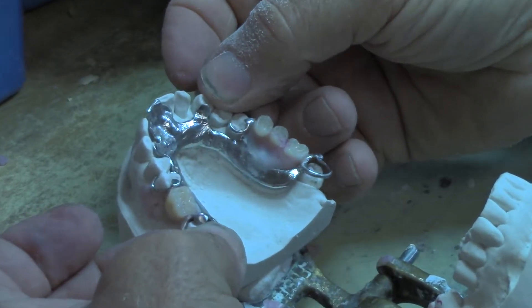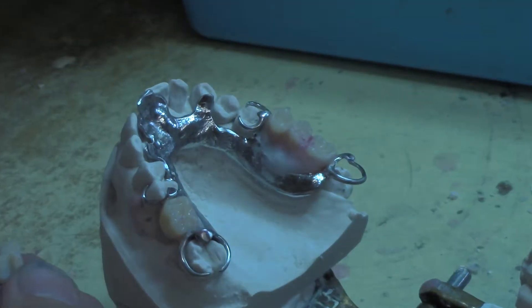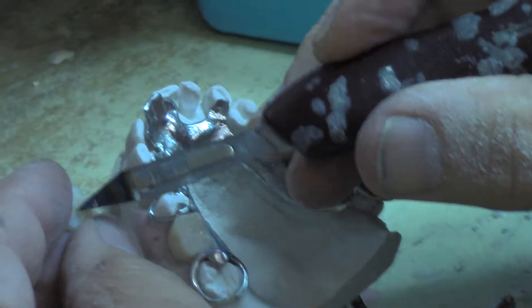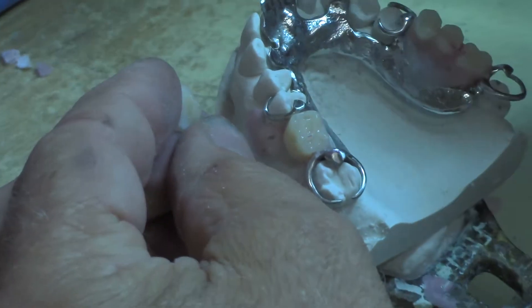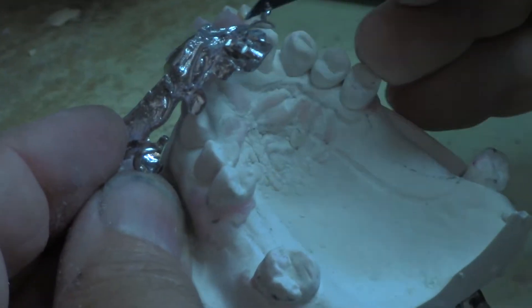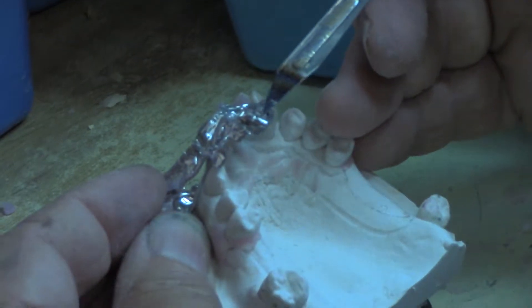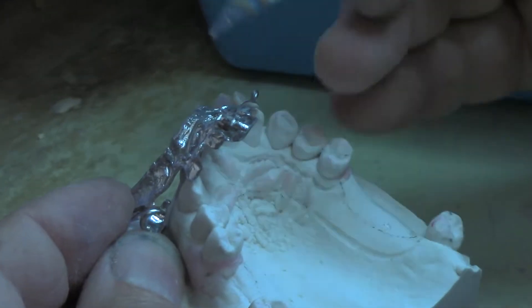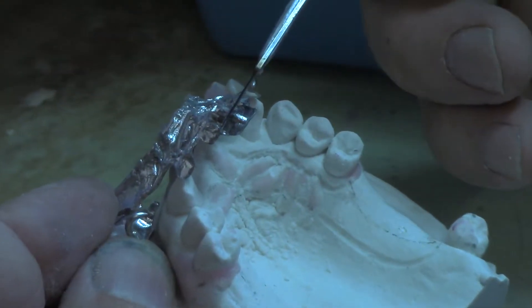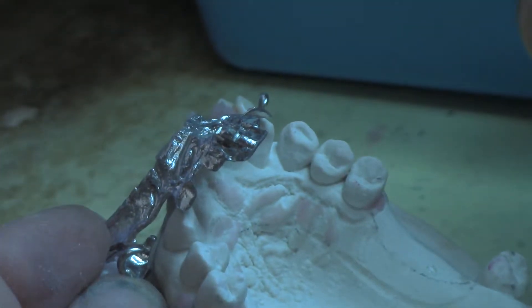I want to show you that little groove here that we put in the teeth when I cast it — and it's on here. So this little groove here, I've prepped it. I took my disc and I cut in this way, also on the other side, and then I cut in this way and this way on it, to give it some retention.